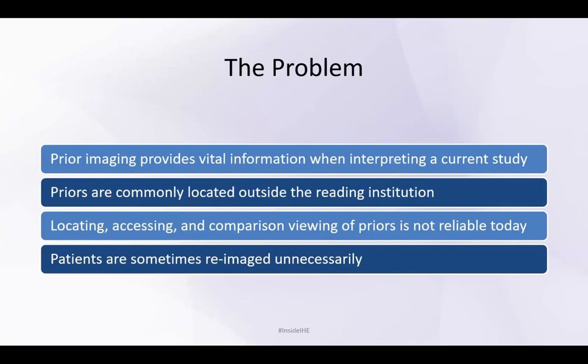And it's not uncommon not to have the previous report. And probably the worst case scenario is that at the end of the day, if we're not able to readily access previous studies, then we'll end up repeating the study. And that means a lot of useless radiation exposure and repeat studies. So this is what I've been going through in oncology.